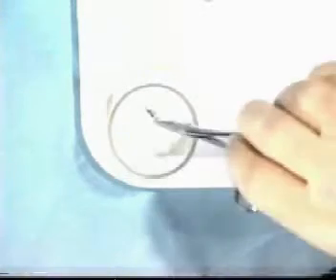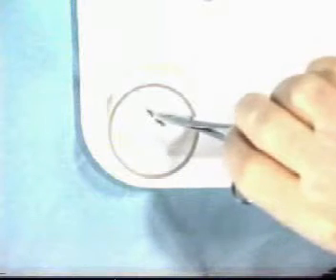You will be provided on your jig with a small glass pot which has a screw in the base of it. Use the same technique as has been demonstrated to tie at depth within this pot. Take your suture and bowstring it in the end of a hemostat and place it around the hook. Withdraw out into the open and you're in a position to tie your first throw.